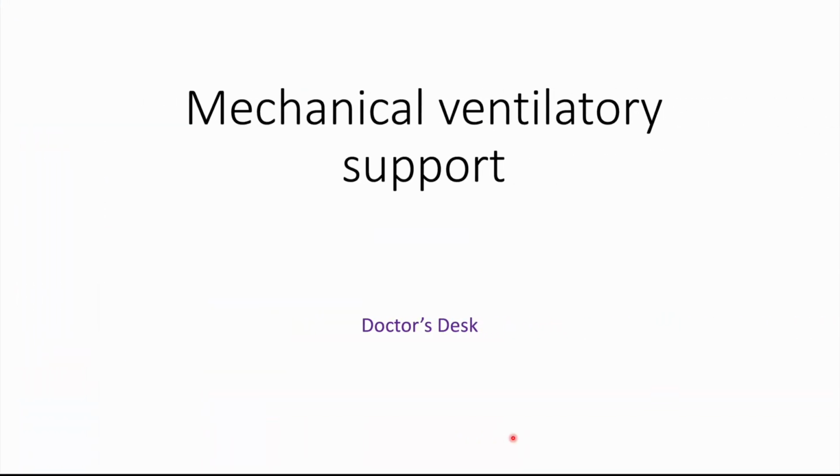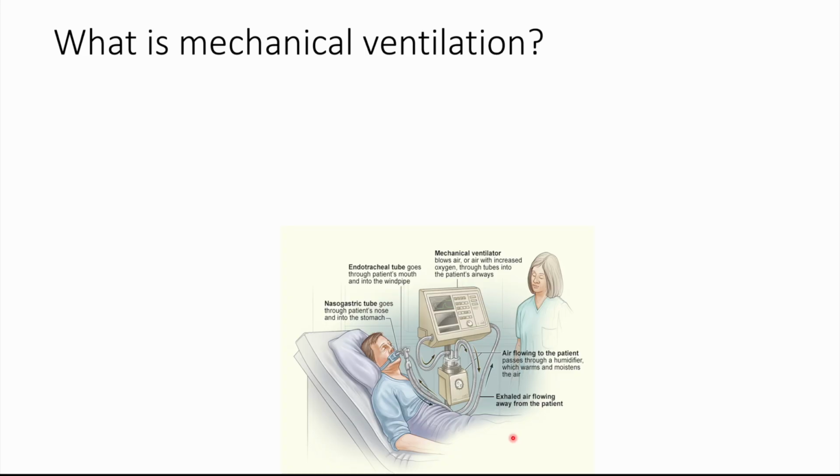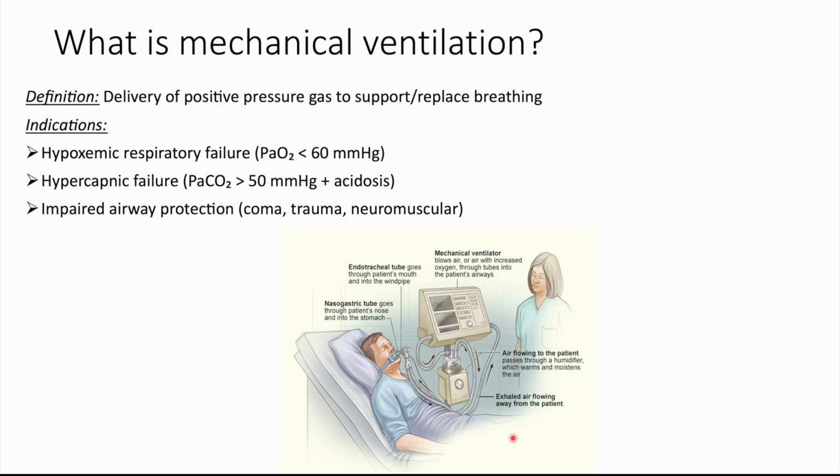So what is mechanical ventilation? It means delivering positive pressure breaths to a patient, either partially or completely replacing spontaneous breathing. So we initiate ventilation for three broad reasons: hypoxemic respiratory failure. Common examples are ARDS, severe pneumonia, pulmonary edema, and massive trauma.